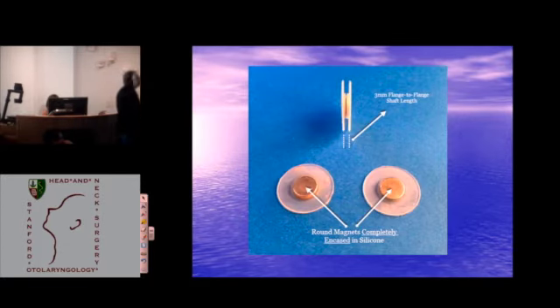And this is what it looks like. Part of the challenge was this membrane. You can encase this, a size 10 round. You can have a round magnet and set it down inside a wall and it ends up being 10. But if you have too thick a silicone over the surface, you start to affect the magnetic strength. So we got the perfect magnetic strength. It's just enough that when you blow your nose, your septal prosthesis does not end up in your soup. And that's the best part of it. Okay, next slide. So that's the concept.